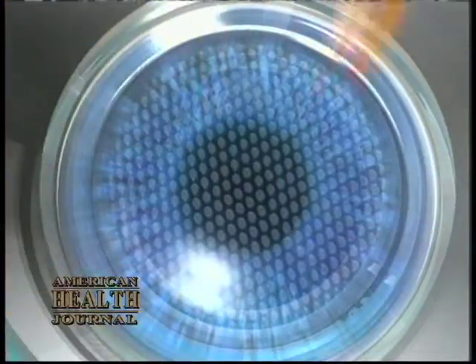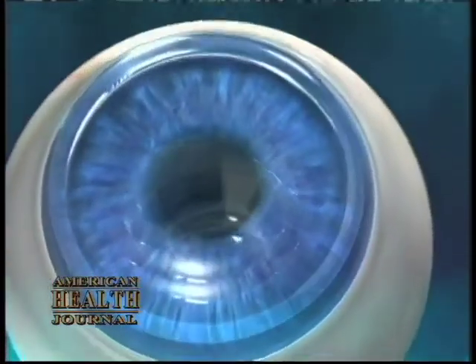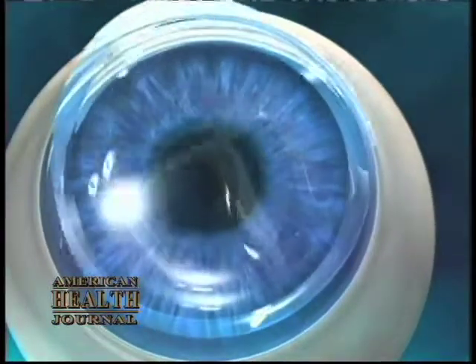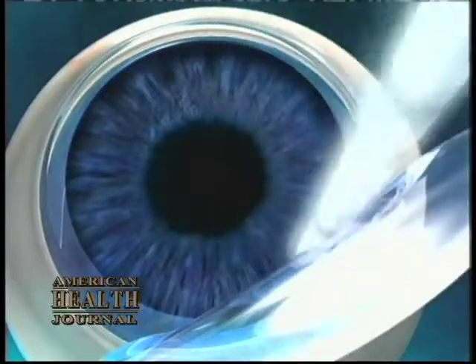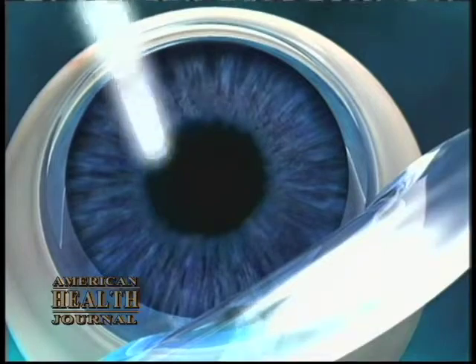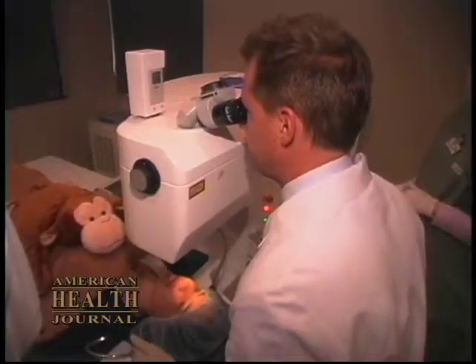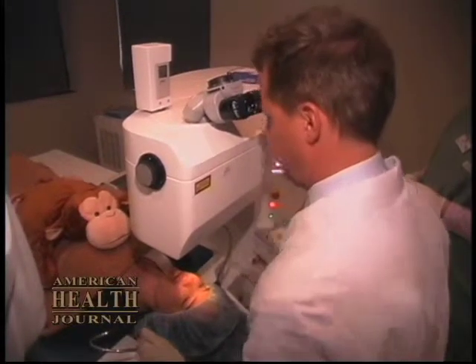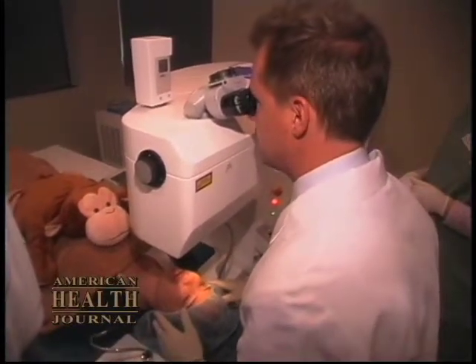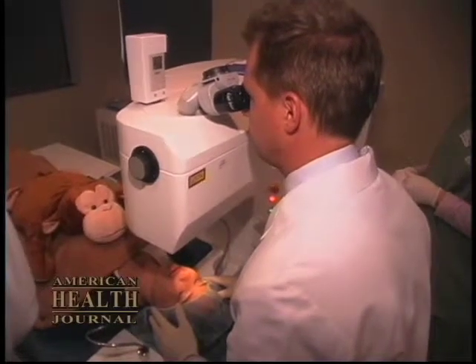We simply lift the flap. There is a hinge by which the flap is attached. We flip the flap over the hinge to expose the underlying tissue. It's the underlying tissue that's going to be reshaped by the second phase, which is the excimer laser-based part of the procedure, where we're using laser pulses to change the shape of the cornea in a way that takes care of or corrects the underlying refractive problem that you have.